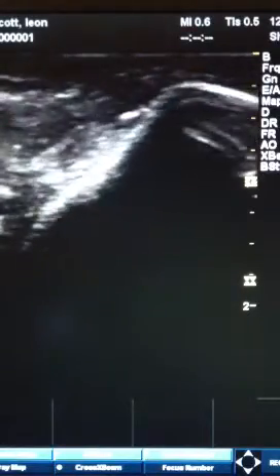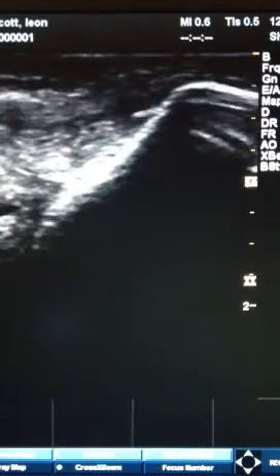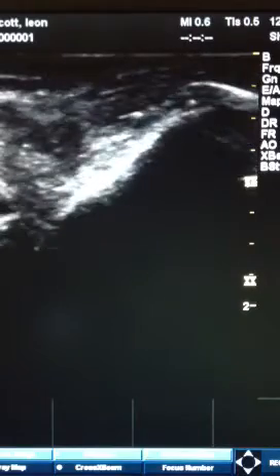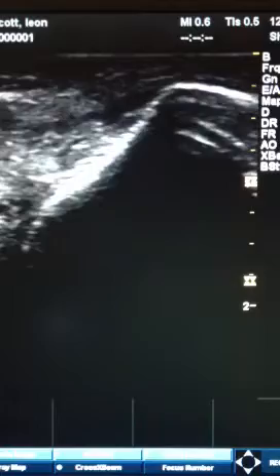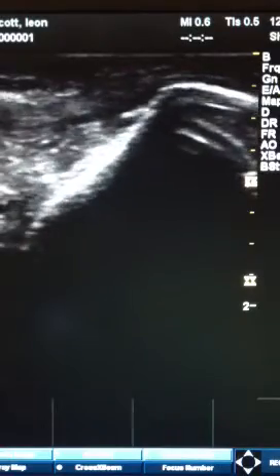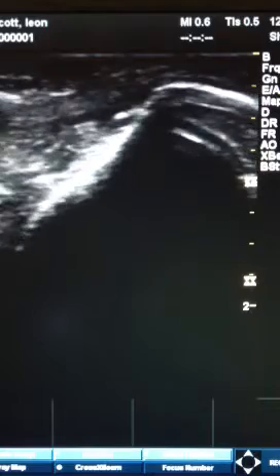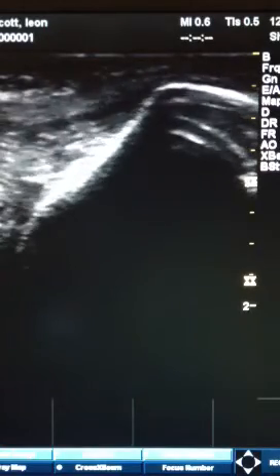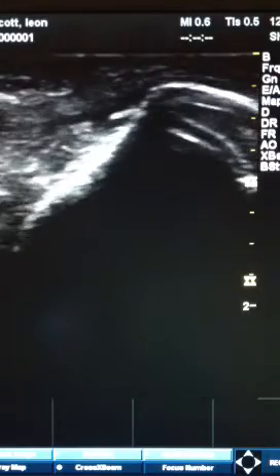This is a wide angle on just a small amount of my elbow. At the very top of that mountain, which is the olecranon — the elbow bone — I'm scrolling in and out of a certain plane and you can see a white line showing up. You can see it right now at the top. It's gone now and it's back.